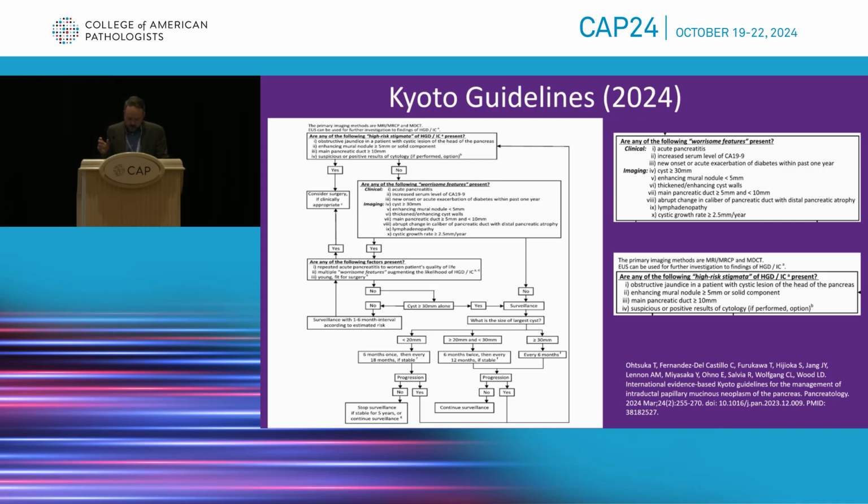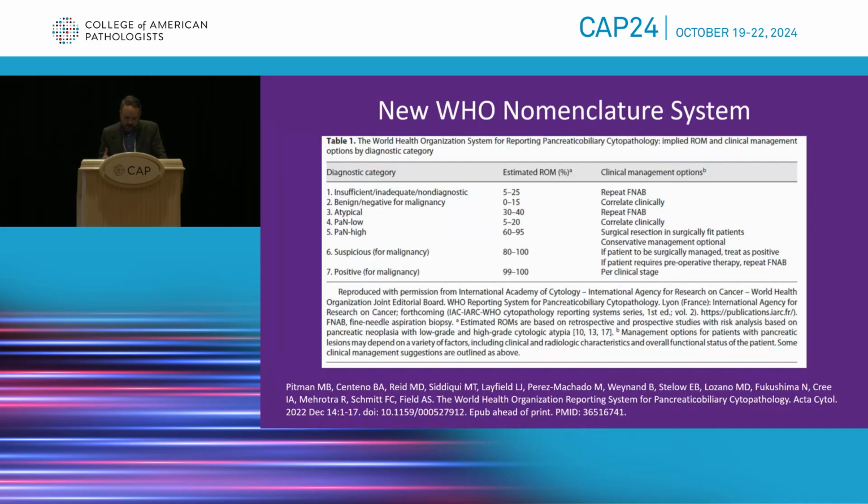And what's important for this with regard to cytology is that if high-grade dysplasia is identified, then the patient should have surgery. And so one task for the cytopathologist, or the person examining the specimen, when you see mucinous epithelium is to determine whether high-grade dysplasia is there or if there's frank malignancy that indicates that the cyst has developed a malignant component.